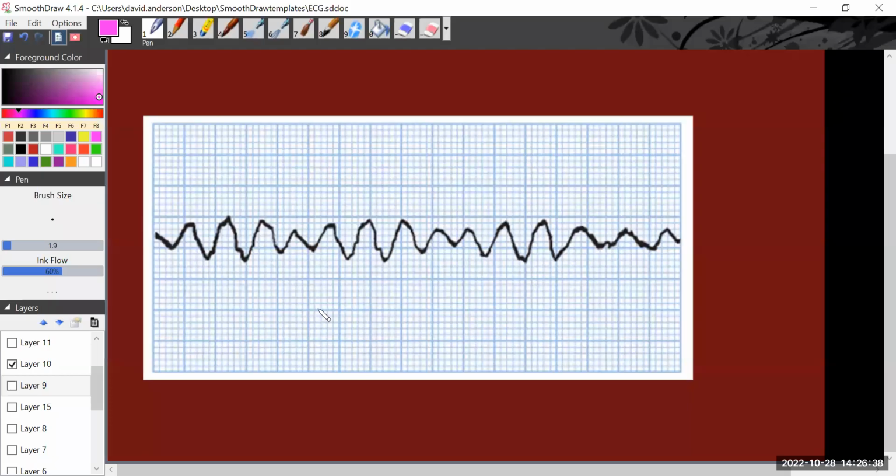And in ventricular fibrillation, we see this varied irregular patterning, fast, uncoordinated quivering of the ventricle, no identifiable QRS complexes, and we obviously don't see that sequence between atrial filling to the QRS with that natural delay. So this is a medical emergency that requires defibrillation to occur.